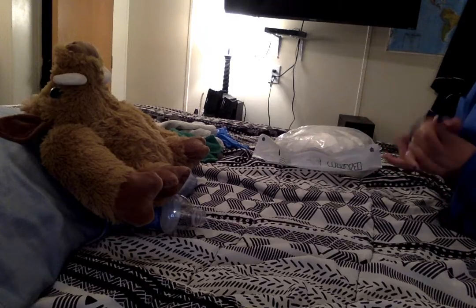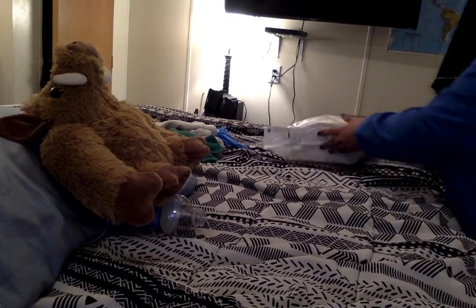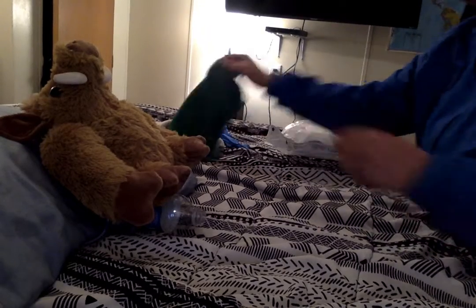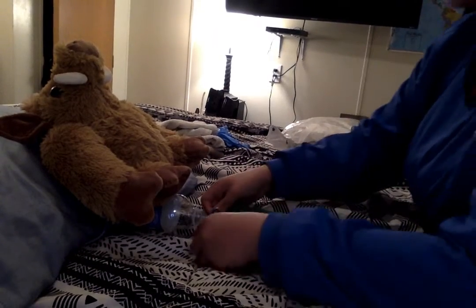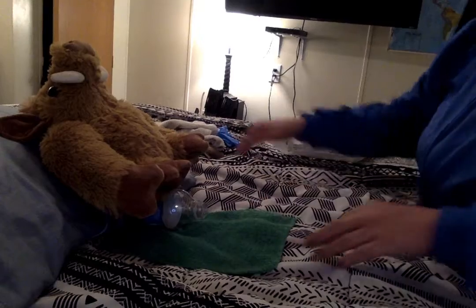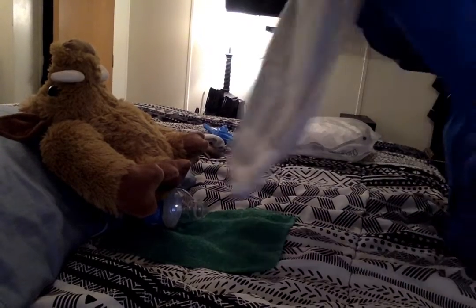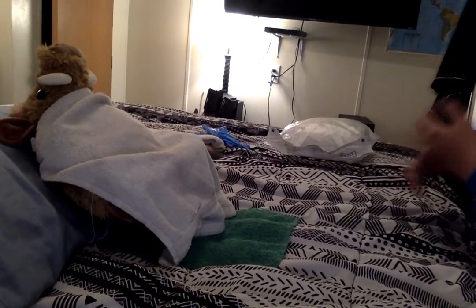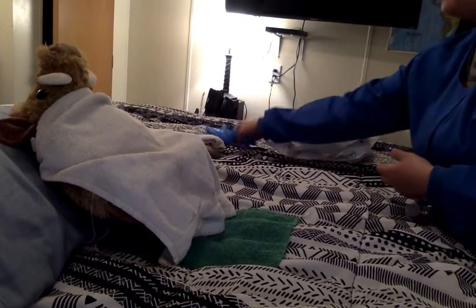We are going to prepare the patient to have the urinary catheter inserted. So the first thing we're going to do is take our towel and put it underneath our patient. The second thing we're going to do is drape our patient for the patient's comfort and make sure she doesn't get cold. The next thing we're going to do is perform our hand hygiene and put on our gloves.